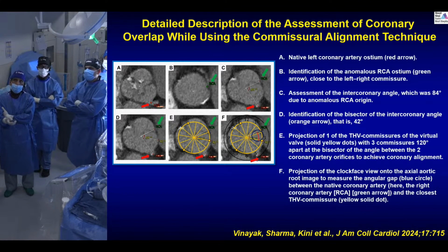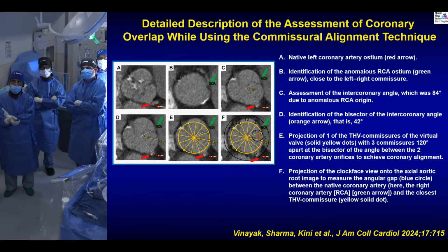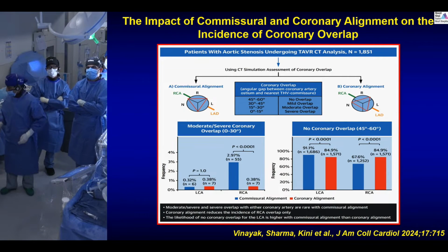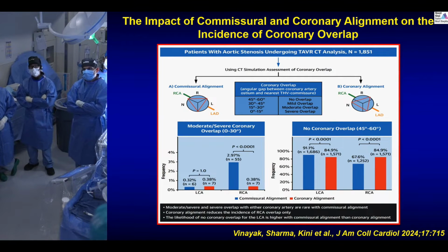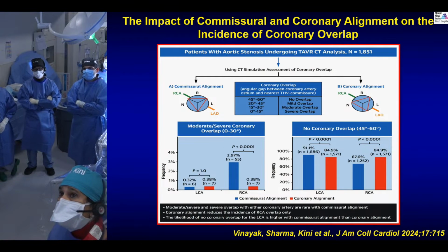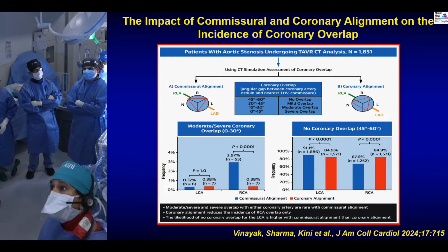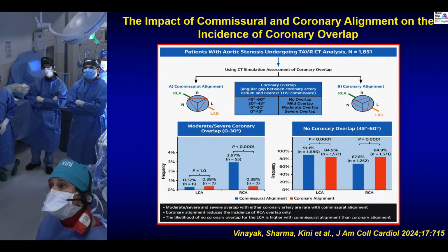Yeah, so this study looked at almost 2,000 CTs to see how often we need coronary alignment. And the answer is rarely. If you look at the central figure and the graph on the next slide, the only time coronary alignment might be helpful is with the right coronary, because it's more variable. It's only 2.97%. Most of the time you don't need it. So the whole concept is that most of the time commissure alignment will be fine. It's definitely important for younger patients, especially Redo-TAVR, for coronary access. You can see, had the commissure been misaligned, this patient's coronary access would be very difficult after two valves. So the bottom line is, don't worry about coronary alignment unless you need to, and most of the time you don't need to.